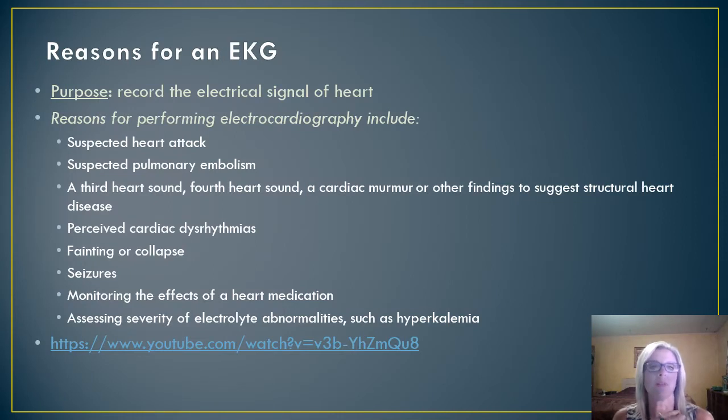So what is the purpose of an EKG? Well, of course, this is to record that electrical signal of the heart and use it for diagnostics to see where there might be a potential problem occurring. We will have careful placement of surface electrodes. We'll put them on the body in particular places, and those can even vary when you're looking for something different. It's possible for us then, as we place these, to record that complex compound electrical signal of the heart and get that EKG wave. We call this an electrocardiogram, which can also be abbreviated ECG, but is commonly abbreviated as EKG.